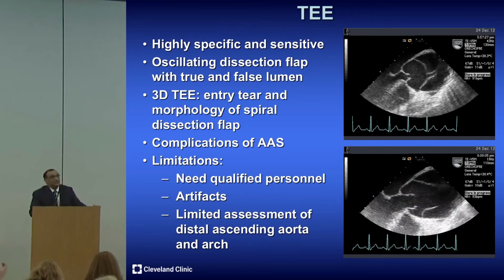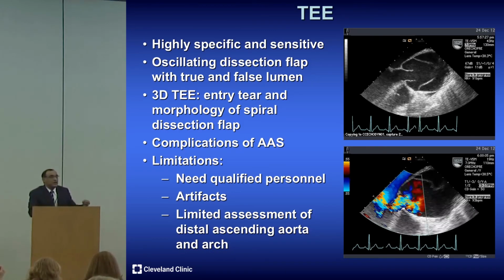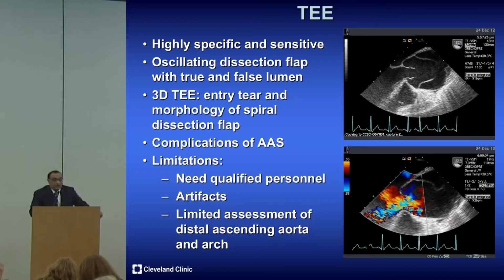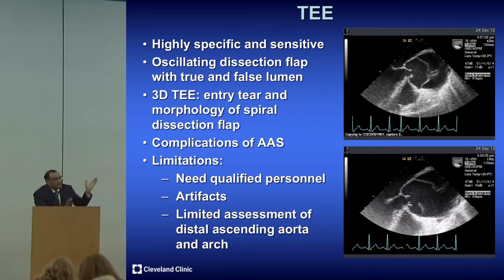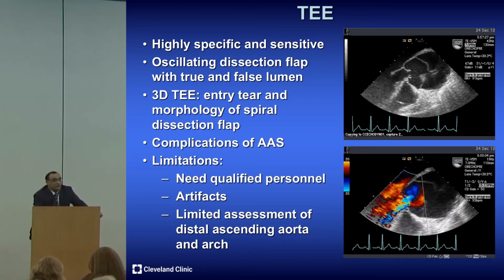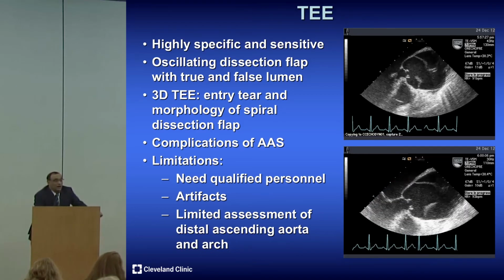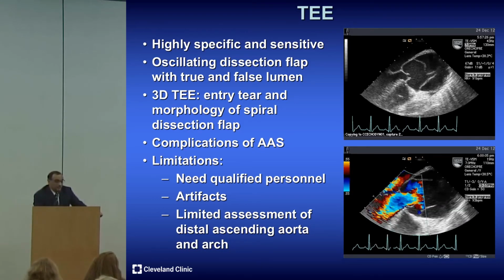Transesophageal echocardiogram is where you pass a probe into your food pipe and take pictures. This used to be a very common way of detecting dissections, but nowadays has basically been replaced by a CAT scan. In the top image, one structure is the valve, and the other one beyond the valve is a dissection flap. You do not want to have that because that's a bad thing, okay? Nothing good is going to come out of that unless Roselli or someone like that gets in and takes care of business. Okay? Nothing good is going to come out of it.